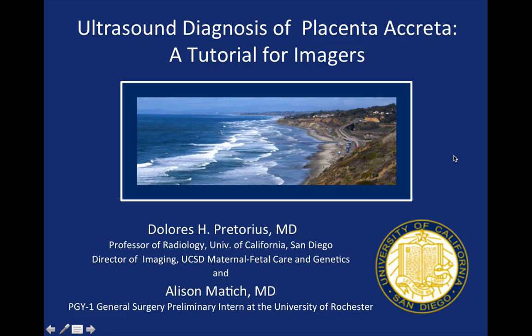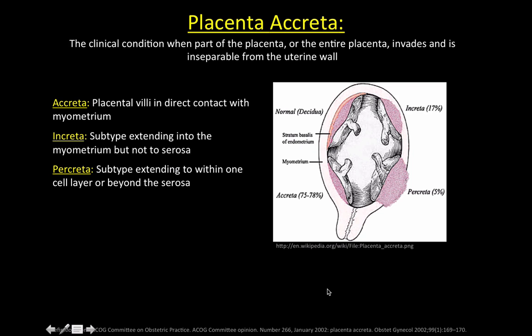I'm going to talk about the ultrasound diagnosis of placenta accreta, a tutorial for imagers, and I did this presentation with the help of Allison Matich from UC San Diego.